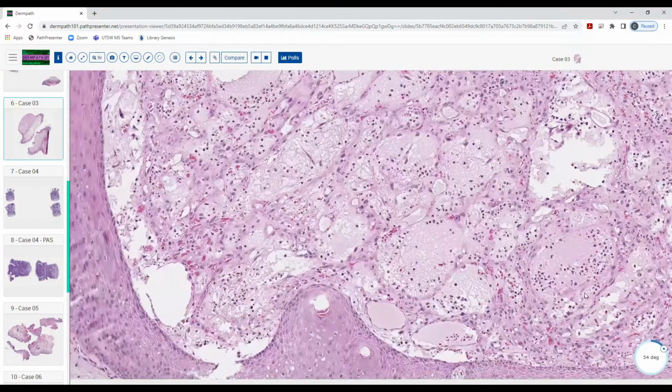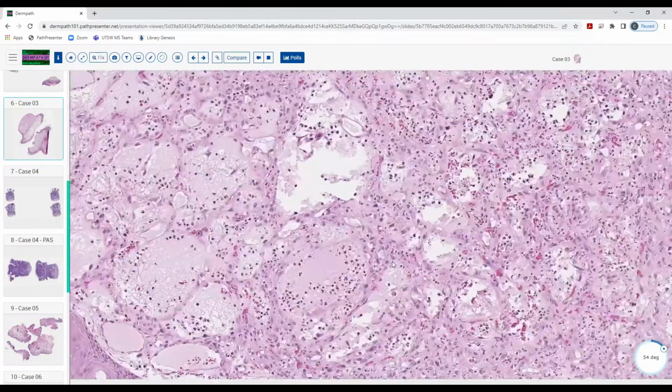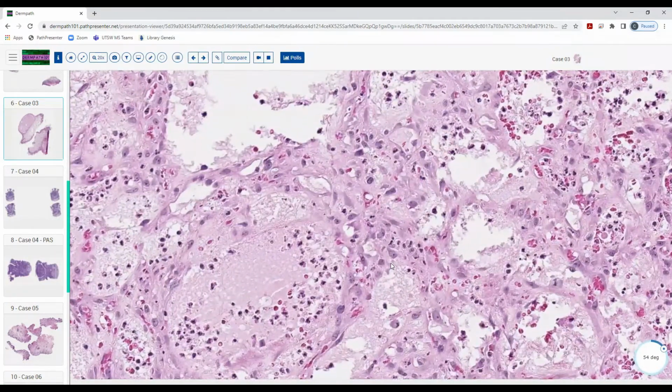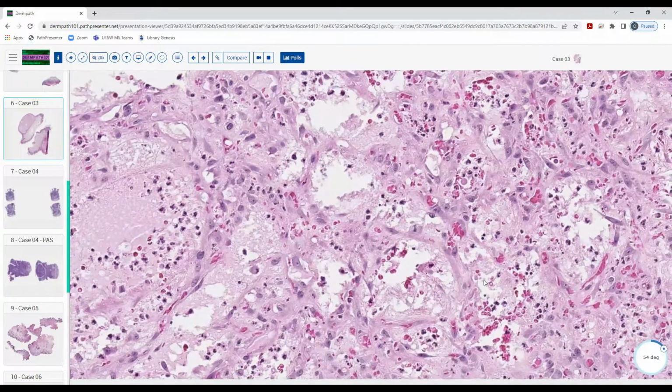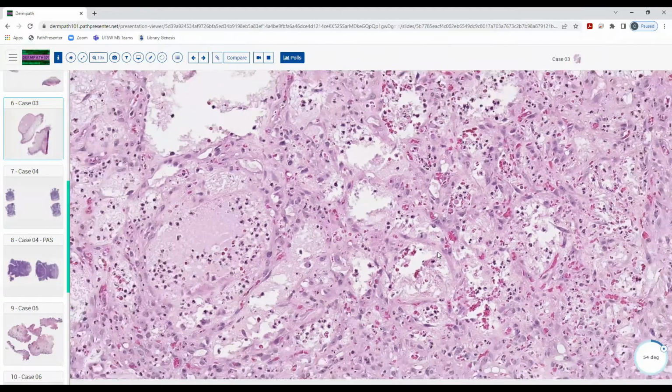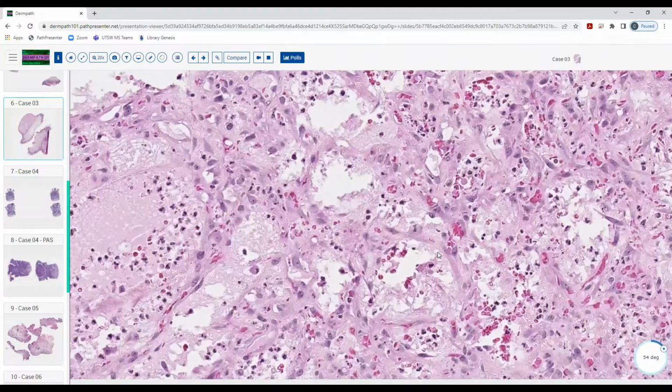Okay. Well, I was going to say it doesn't really go with what I was thinking, but when I see capillary proliferation, I would think the neutrophilic infiltrate would be much more dense for something like bacillary angiomatosis. But I think I was thinking about that. It would be probably more hemorrhagic than this, but I'm not sure what the stringy pink is that you're getting at.